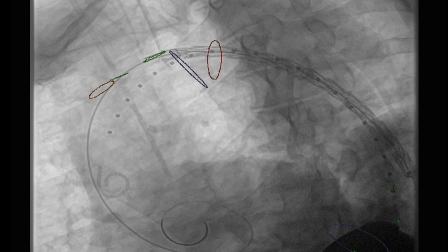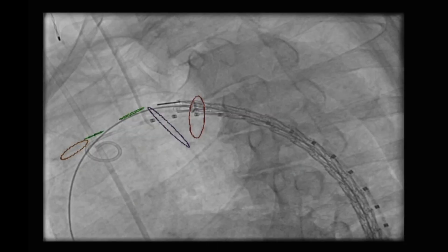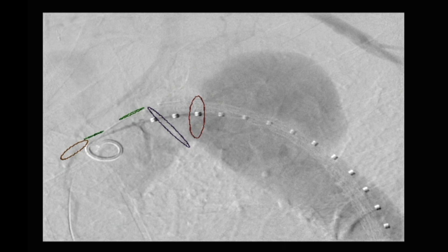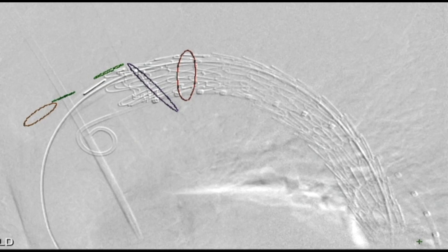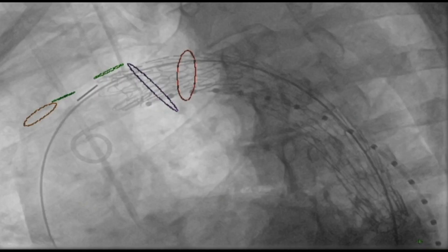Here the stent graft has been brought up into place — in this case it's 34 by 14. We then inject and confirm the origin of the subclavian artery. We're going to have to move the device forward just a little bit. We almost want to impinge upon the subclavian artery to maximize the proximal end. You can see the accuracy of the fusion off the original MR scan.